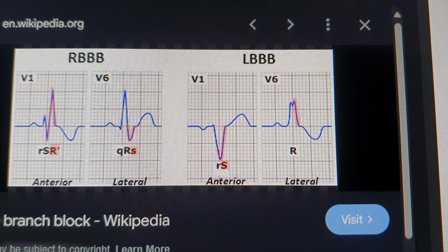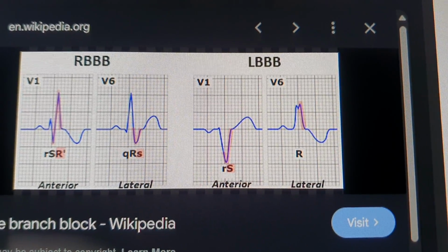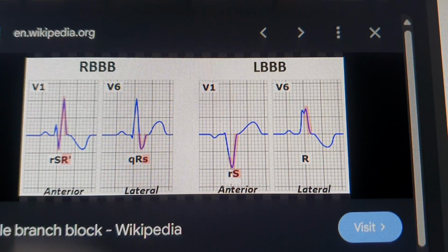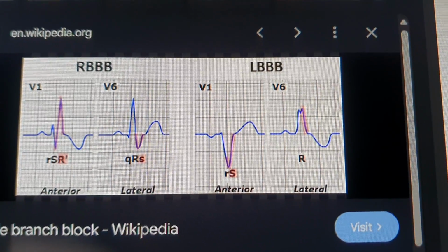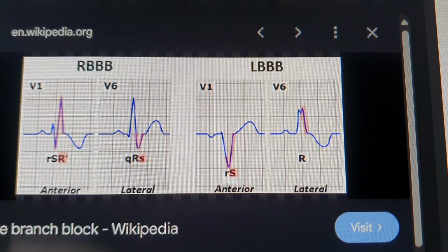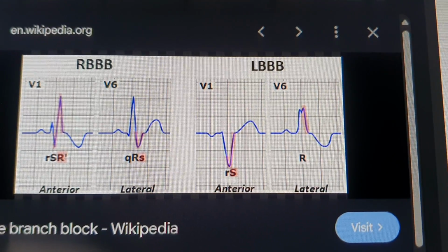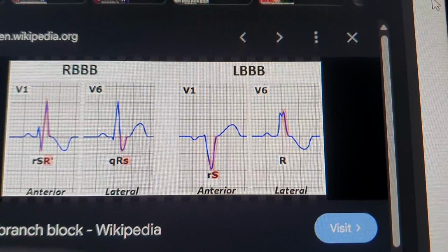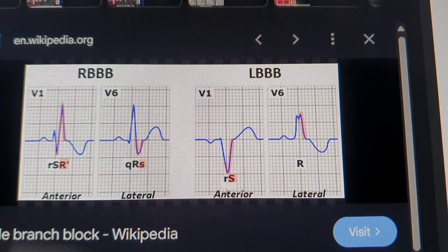LBBB morphology comes usually from the right ventricle, many times the right ventricular outflow tract, and on rare occasions it can be related to arrhythmogenic right ventricular cardiomyopathy, and this is of course a very not good situation. But most of the time right ventricular outflow tract PVCs are quite benign, and therefore LBBB morphology PVCs are considered more probably benign, or less concerning usually, if you don't have, for example, an epsilon wave that would tell you that we are talking about arrhythmogenic right ventricular cardiomyopathy.